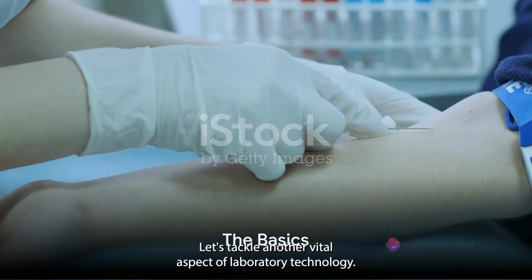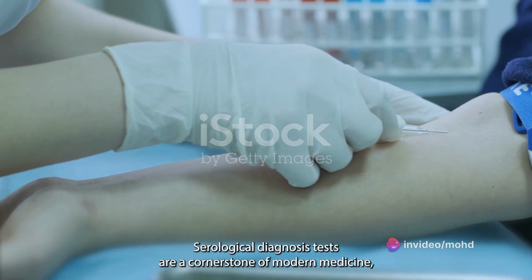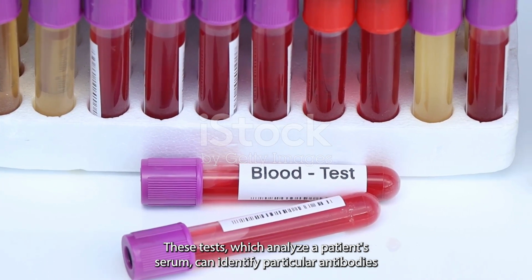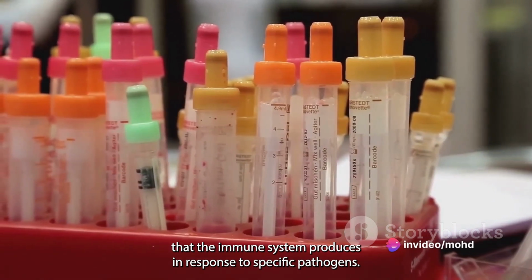Moving on, let's tackle another vital aspect of laboratory technology: serological diagnosis. Serological tests are a cornerstone of modern medicine, playing a key role in the detection of infectious diseases. These tests, which analyze a patient's serum, can identify particular antibodies that the immune system produces in response to specific pathogens.